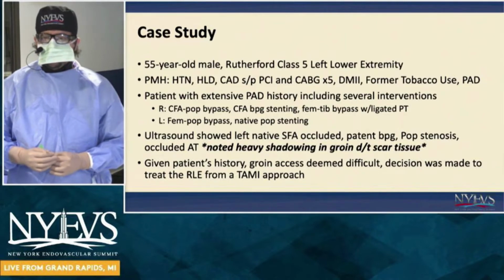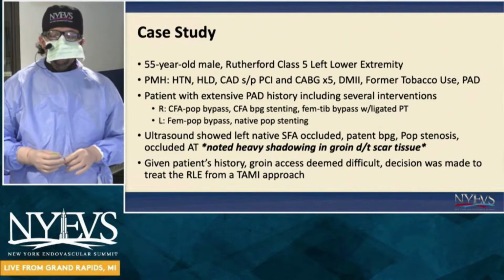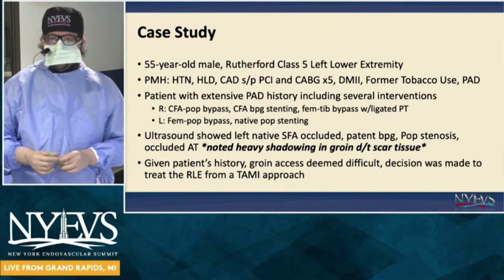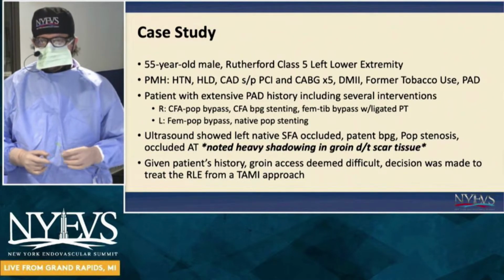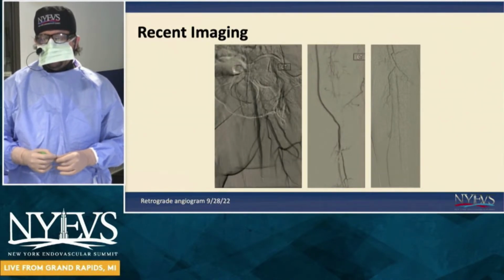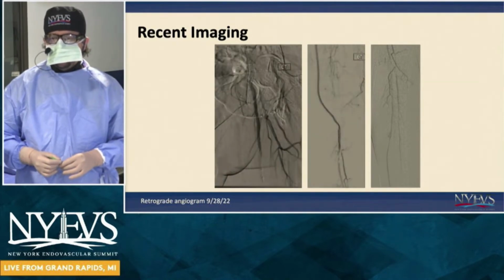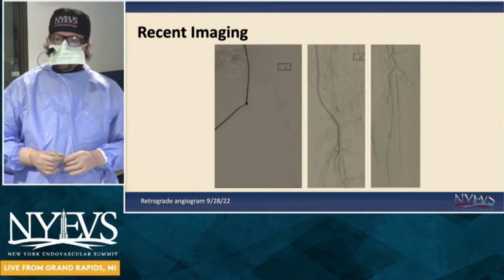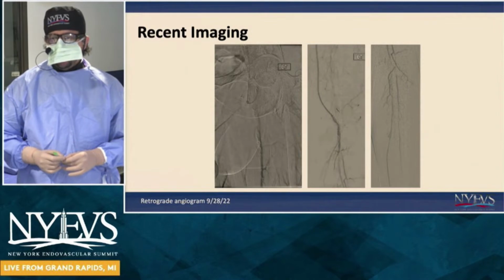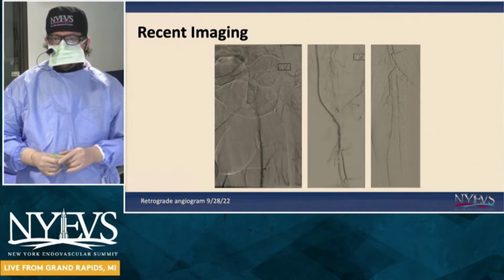Underwent revascularization on the right side. He has a femoral popliteal, but I don't know if it's a popliteal. I think it's a fem-TPT bypass, and I'll be interested in what the panel thinks, with monophasic flow in the bypass graft. Can I see the next slide, please? And this is diagnostic images from the left side when we treated the right side. And they're playing. You can see in the middle panel there peroneal lesions, obviously, in the TPT-PT junction, and the outflow distally there. That's, again, an image from the left groin.